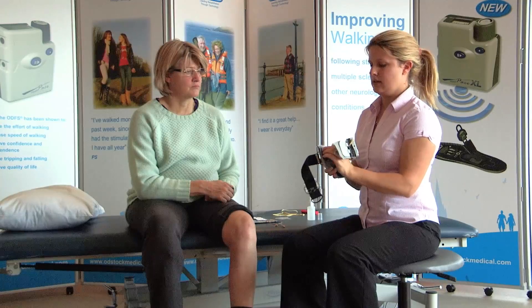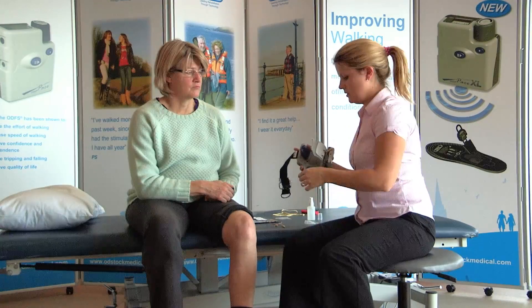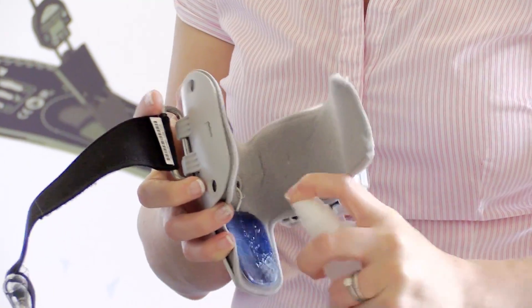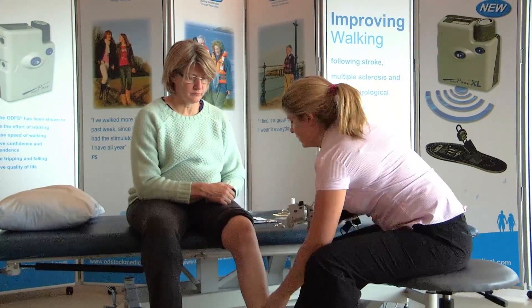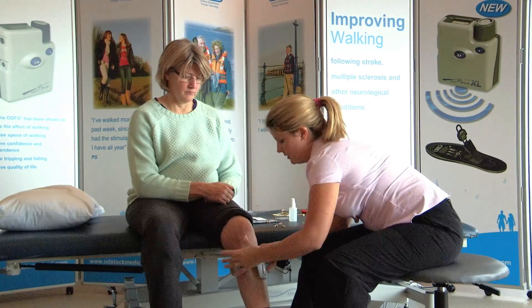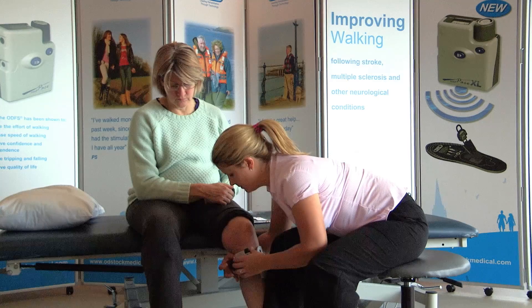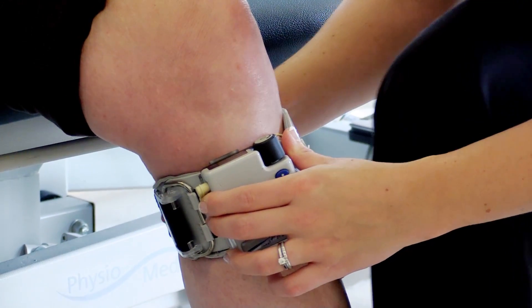Once you're ready to fit it, take the plastic covers off. Give the electrodes a spray of water. Check your alignment to the tibial tuberosity, open up the cuff, and place it on. Check you've got the strap the right length, bring it round, hook it in, fasten, and adjust as required.